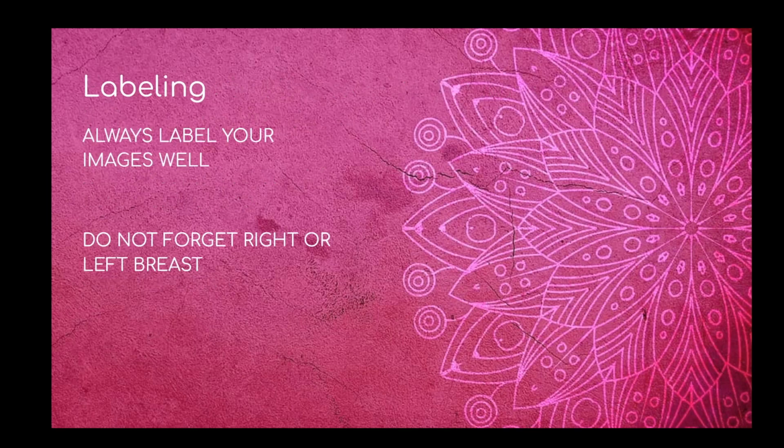Now when we label our breast ultrasounds, we have to make sure that our images are labeled well. We are kind of creating a roadmap for whoever comes after us. So a lot of times the patient is in our office, they have that diagnostic mammogram, they come to us, we scan, we might find something that we want to biopsy. More often than not, you're already booked for the morning.